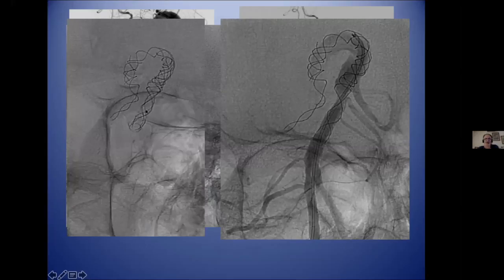This is the Leo stent. You see more quantity, more number of Leo here, and when I talk with the engineer, with 3 Leo stents, I have the same effect of a flow diverter because the cell is closed.